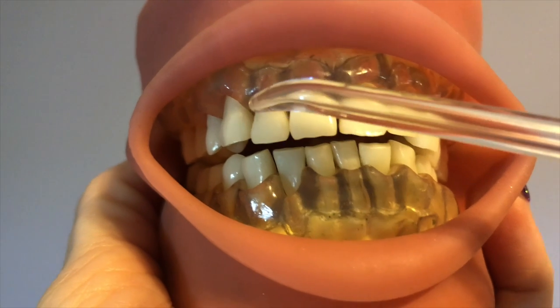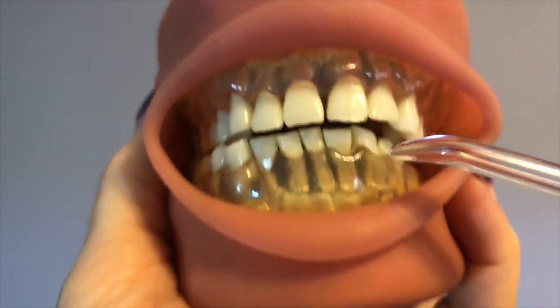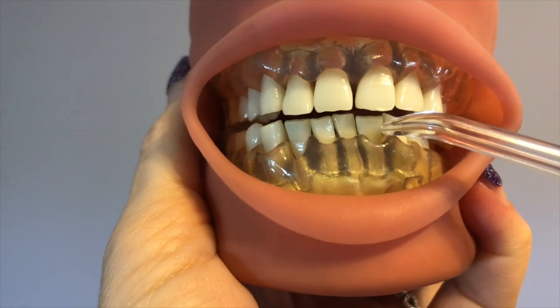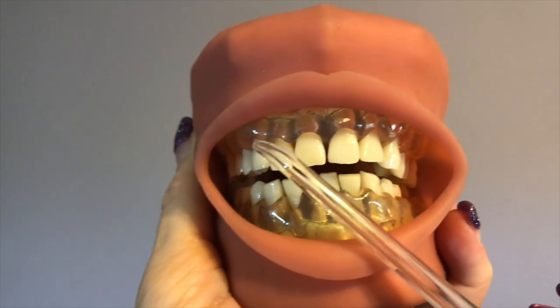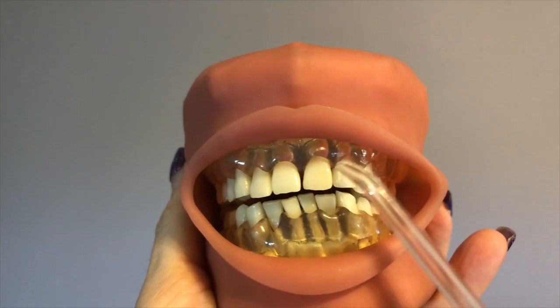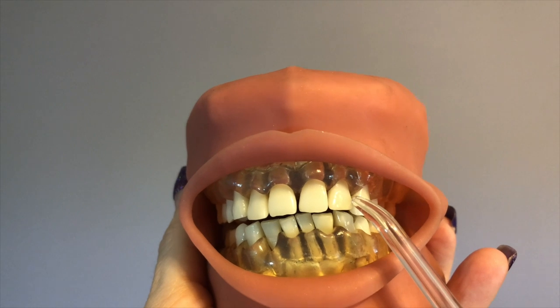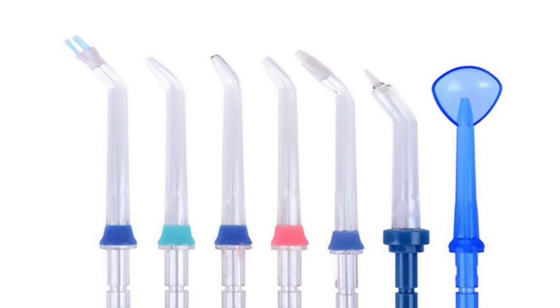And one of our key opinion leaders, Amber Auger, said, I tell patients to make M's and W's around the teeth. And I thought, how simple and how great for kids, right? They understand the alphabet. So when they're using it, go around the tooth on top in an M shape, go around the tooth on the bottom like a W. And then you want to hold it briefly, for a few seconds between teeth. And so those things, right? If your child is not a good brusher, it's also going to help not just to clean between teeth, but it's going to help get that plaque that they're not getting through toothbrushing.